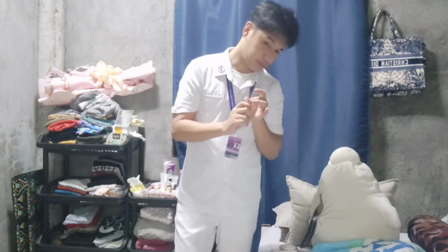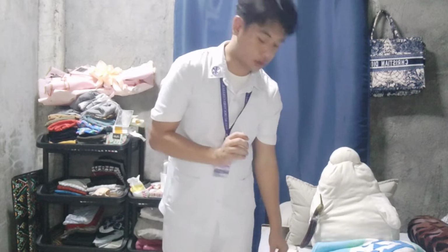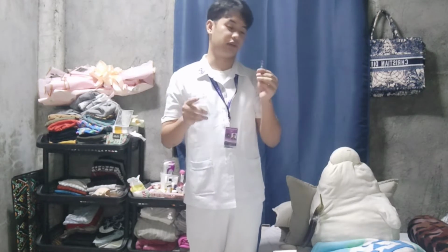Next, use an ampule opener, or place a piece of sterile gauze or alcohol wipe between your thumb and the ampule neck around the ampule, and break it off by bending it away from you to ensure that the ampule is broken away from you. This is so the ampule glass only breaks off away from yourself, to prevent you from being injured or pricked, and so that the discharges of the medication will not go to you.